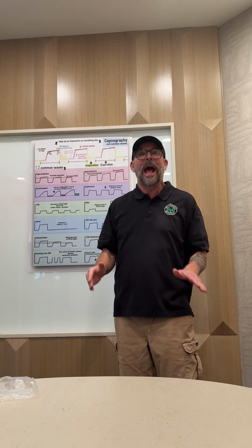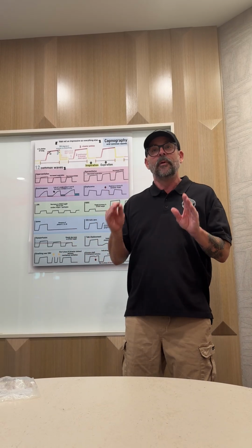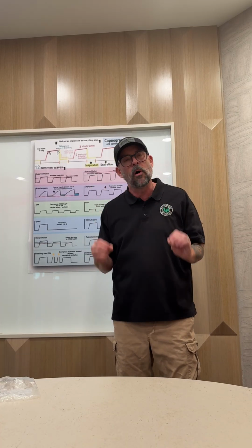End tidal CO2 is one of the biggest tools in our toolbox that we can use, especially when we are out in remote environments. We have long transportation times, and we are going to have these patients for an extended period of time. It is one more big tool in our toolbox that we need to use on a regular basis.